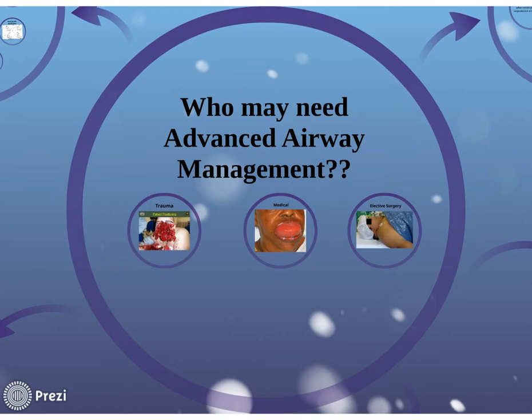Aspiration for blood. Whatever is left in there, he's not really going to be able to have an airway. Can't really maintain it very well. But the rule of thumb is to always go where the bubbles are. But realize bubbles, did you ever burp? Just saying. Bubbles come out of the tummy as well, too. So if you use the only theory of go where the bubbles are, you might have an issue and get it in the wrong place.